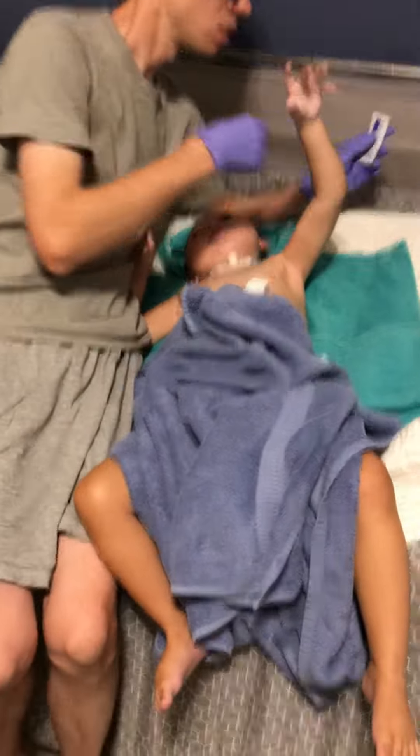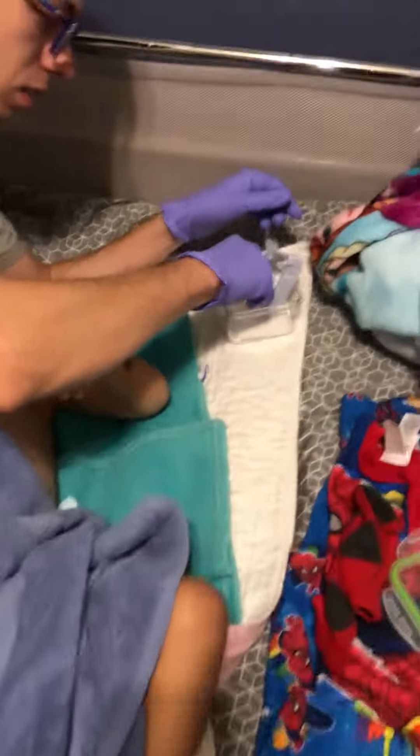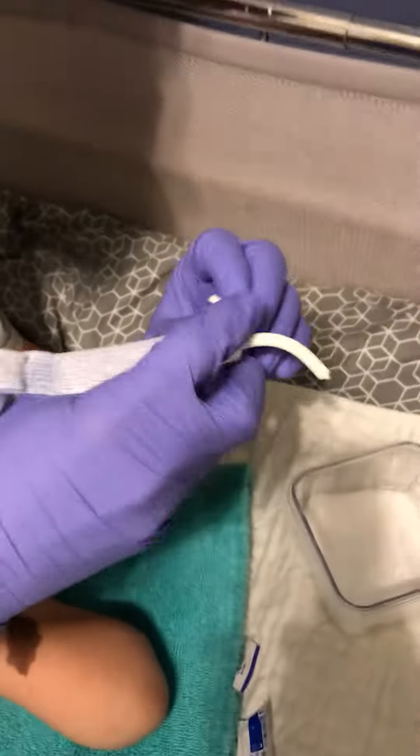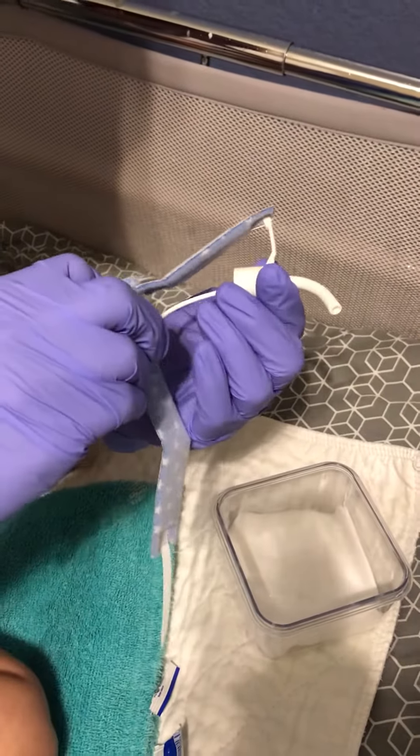We're here with Mr. Lua and we're going to change this trach. This is the lubricant. Then I'm going to get the trach, put the lubricant on the trach. The obturator for the trach is already inside the trach.